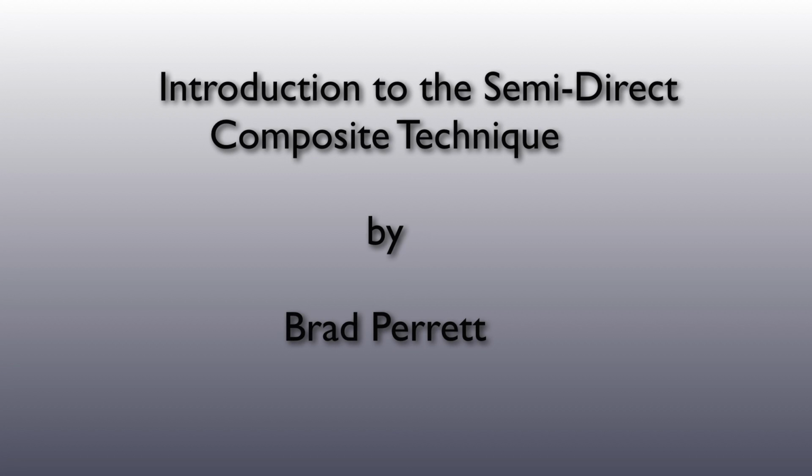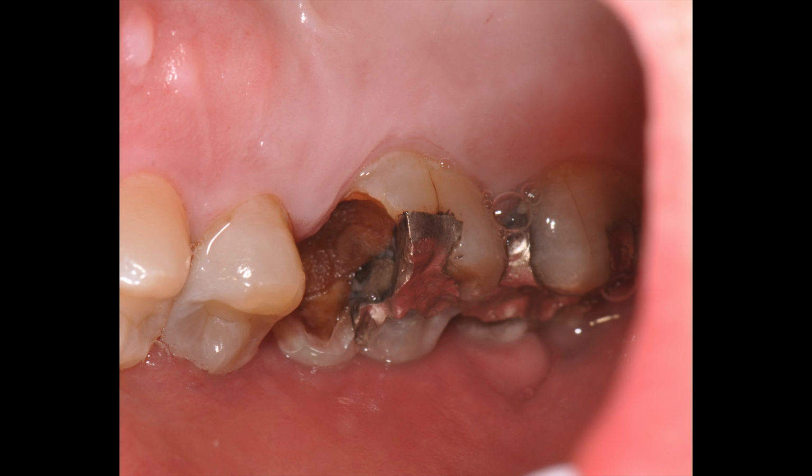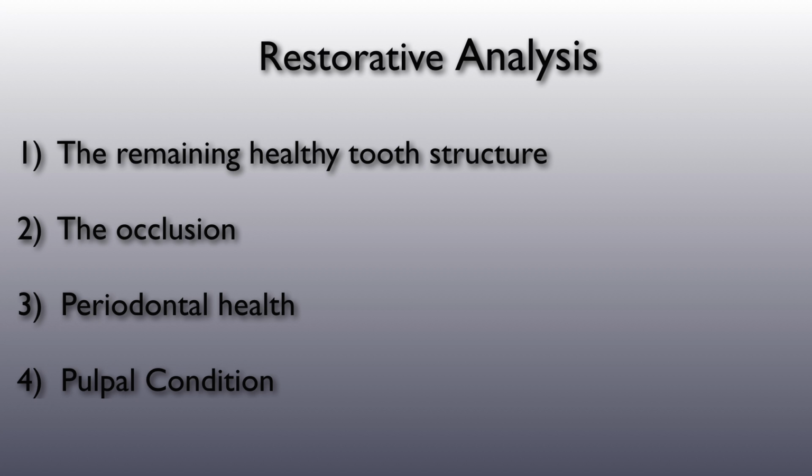I want to introduce you to the Semi-Direct Composite Technique. I have found this technique to be very useful in cases with extensive decay in which I do not want to remove healthy tooth structure but need to provide a restoration that will replace the lost tooth structure and return the tooth back to function.